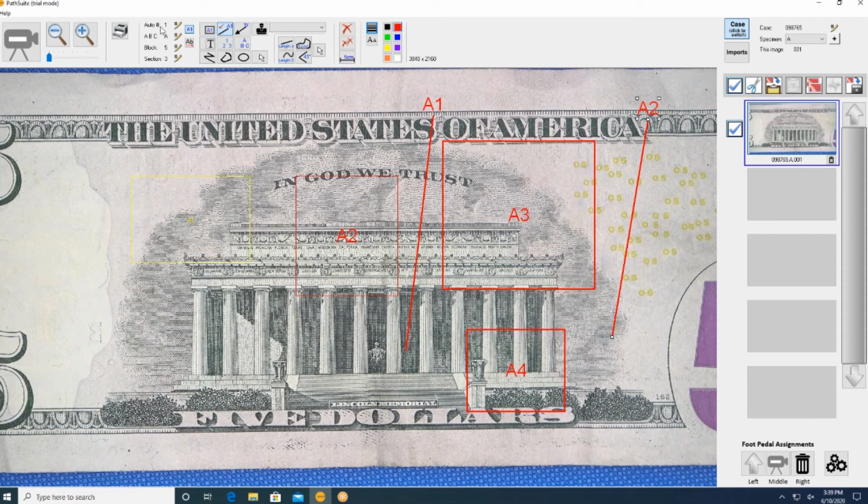And then if you have to change a label, you can just come into the block label or the section label and reset them. Okay, and then it would be reset. Okay, so the next thing that we would want to show would be the PathMobile, and then go to questions.